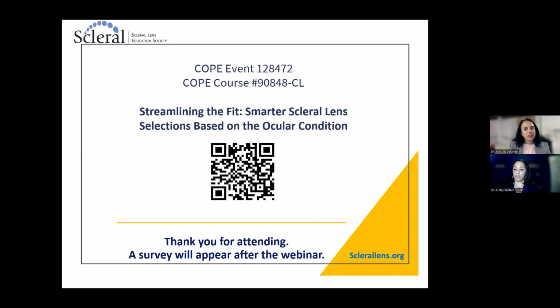And then about the time they said, have you thought about doing, I guess it could be called bi-elevation or quadrant specific corneal, I thought, oh my gosh, could that be what's going on? And then we designed the lens. I'm sure every manufacturer has this option out there. I know one of them markets a specific lens for it. That's not the lens I used. We actually designed this one ourselves, but there are lots of these on the market to do that sort of saddle shape lens now.